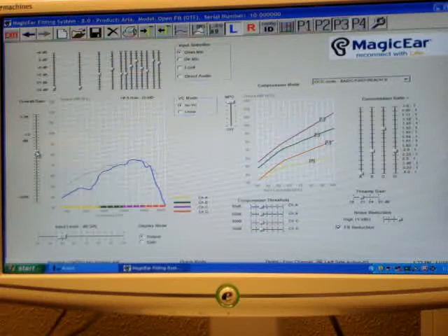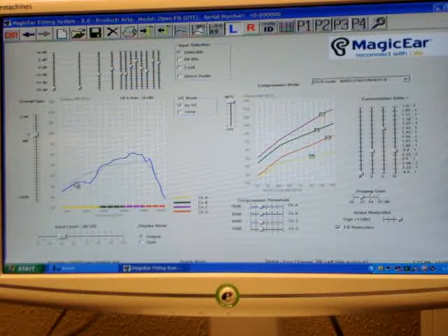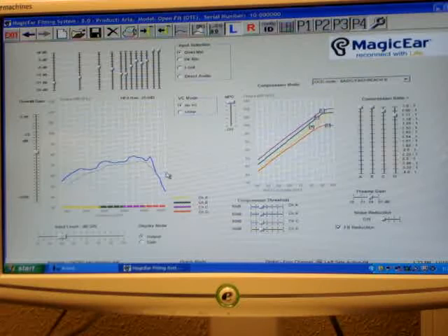This is your overall gain, so if they want it louder, we can just increase the slider. This gray line is their target gain according to the computer's calculation, so you'll know whether you're above or below their target. Memory 4, and then you can also adjust the compression level at each individual channel.